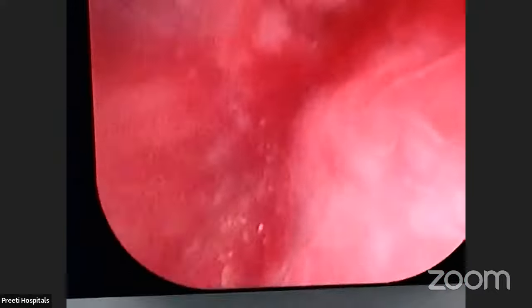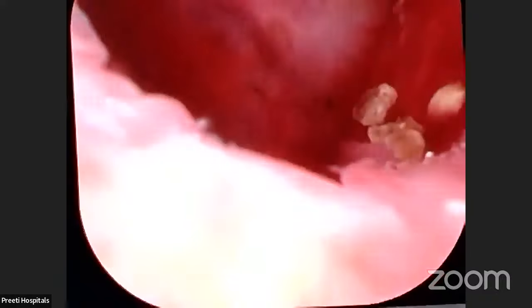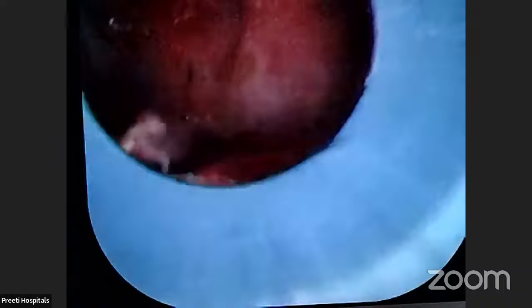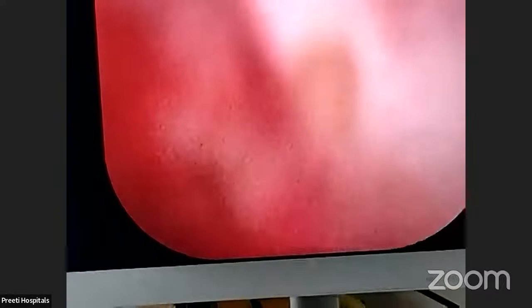So that is the next level of RIRS, where see, you can move like this, suck, suck, suck, suck, suck. See, where will the pressure rise if this much suction is there? What do you say? And at the end, if you inject contrast, the collapsed calyx will be seen. No intravasation, no extravasation.